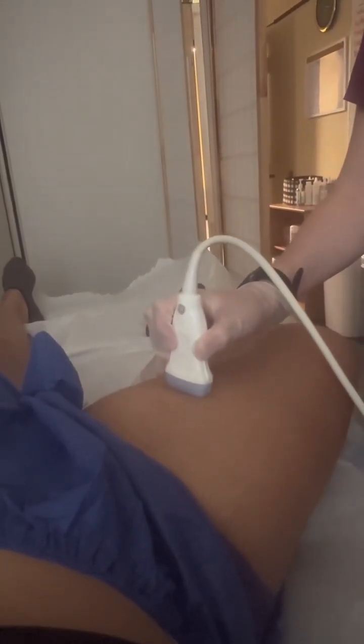Before starting the exam, I'm going to do a quick sweep with the proximal thigh, mid thigh, and distal thigh, as well as behind the knee.